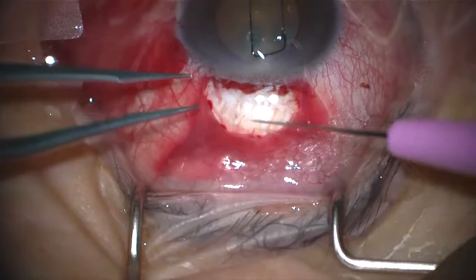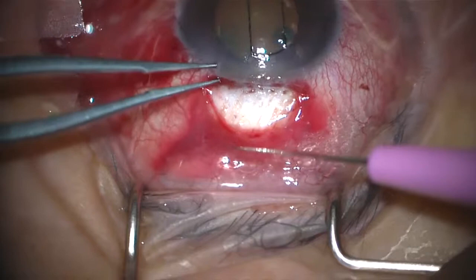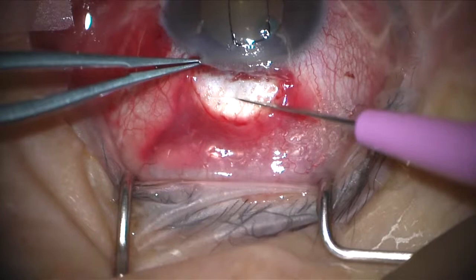Just dry that for me. So I've got tooth forceps now, but I'm holding on the anterior edge, so I'm not at risk of tearing the conjunctiva.